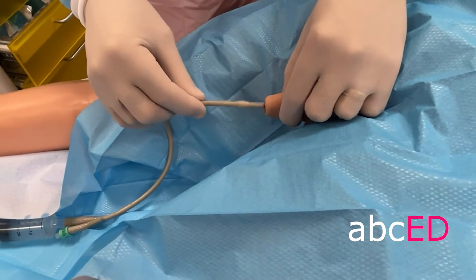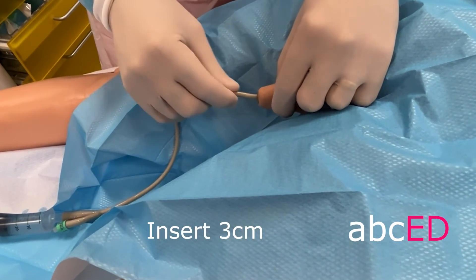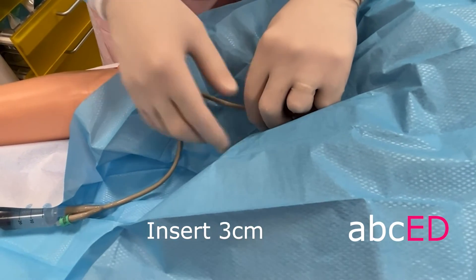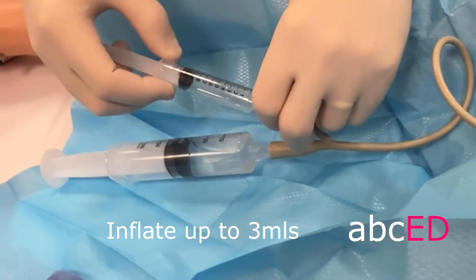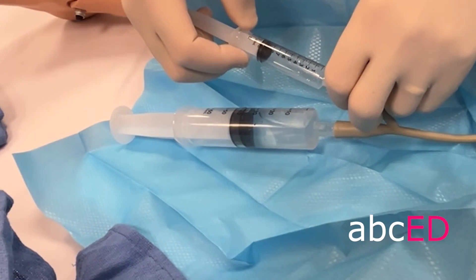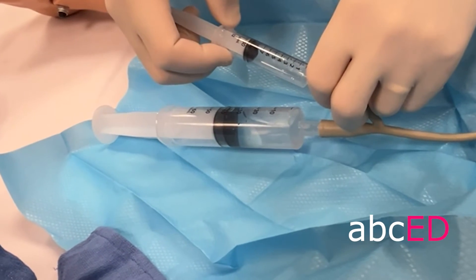Insert the catheter into the meatus 3 cm. Gently inflate the balloon up to 3 mils, or up to the point where the patient experiences discomfort.